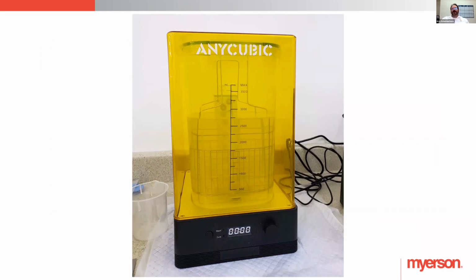Cleaning these materials is very, very important. There's residual resin left on the material. One thing that's really nice about Trusana is it's very fluid, a very liquidy resin, and so it cleans off nicely. I was at a lab last weekend doing a training, and we were dealing with a couple of other based resins, and they're very thick, very gummy, and Trusana is not that. With Trusana, you're going to use alcohol to clean it right now. We're working on some cleaners that might be a substitute that would be less harsh to the resin. The resin can be deteriorated by IPA, by alcohol. It's astringent. I mean, it is some wicked stuff.